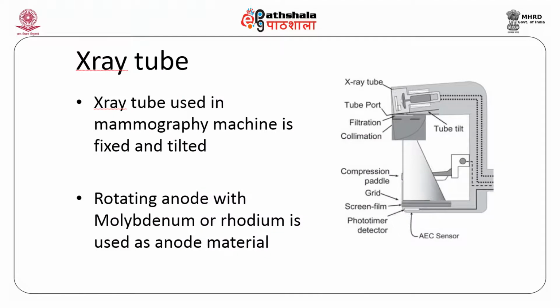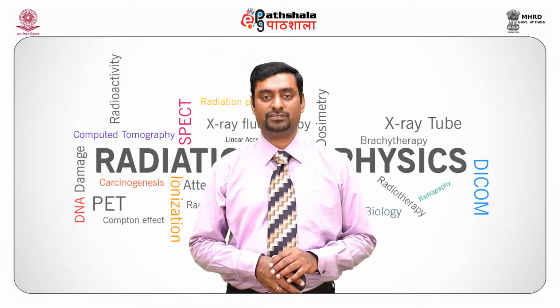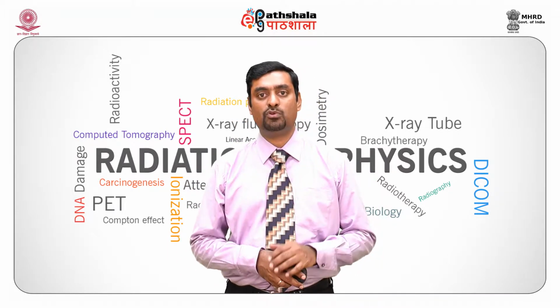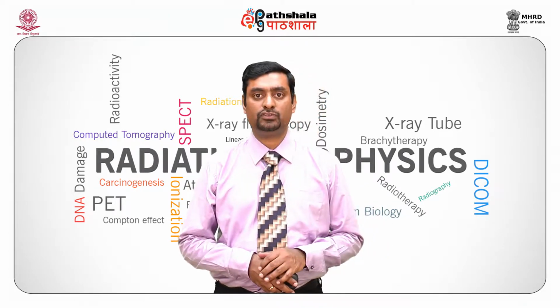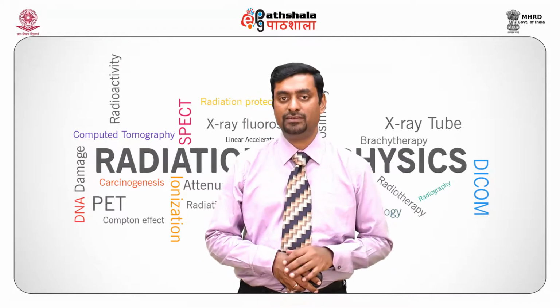X-ray tube. The X-ray tube of a mammography machine is fixed, but as seen, it is actually tilted. It has a rotating anode X-ray tube with molybdenum or rhodium as the target material. Generally, a conventional fluoroscopy machine has tungsten, but a mammography machine has molybdenum or rhodium. Currently, for tomosynthesis procedures, some companies manufacture tungsten targets because of high heat loading.